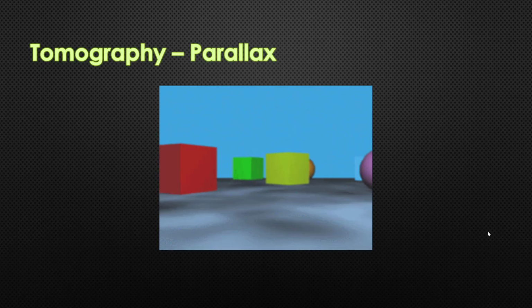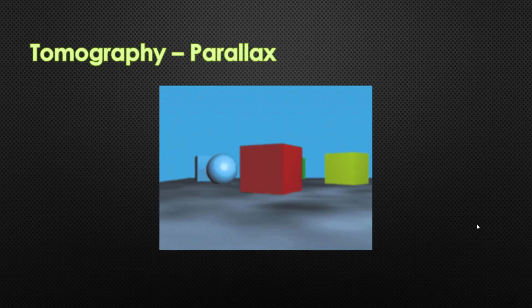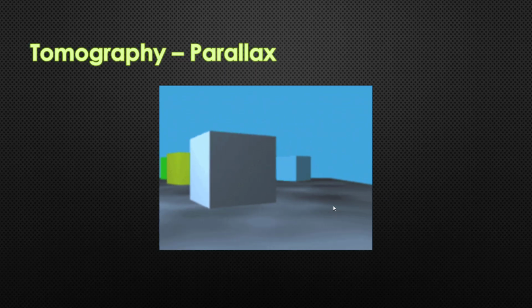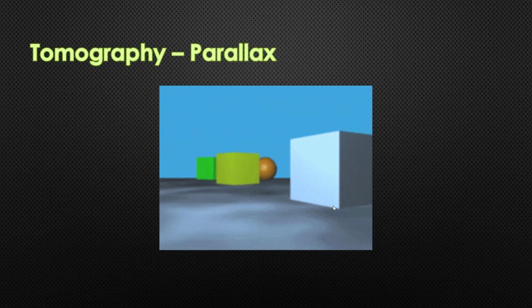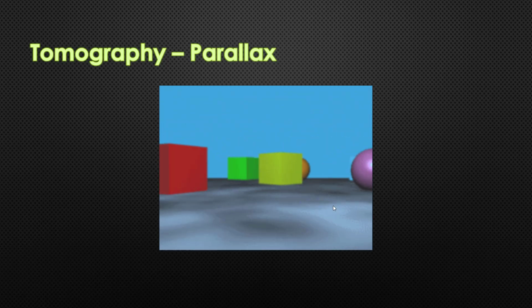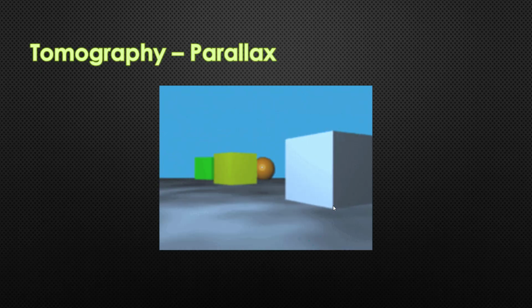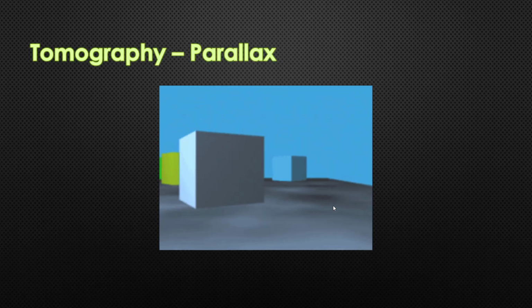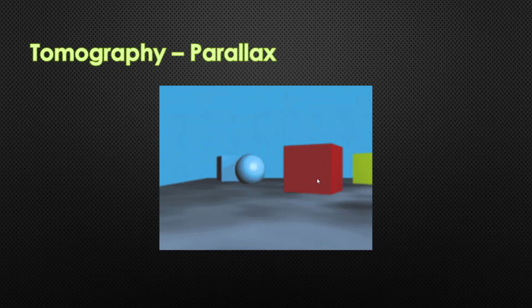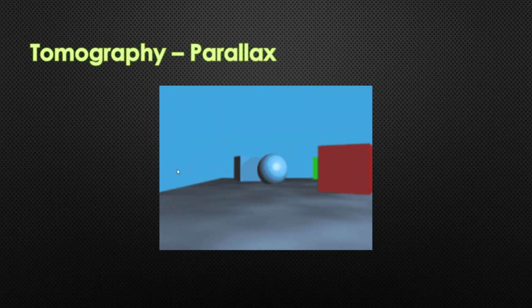So this is the parallax principle. It looks like our eyes are moving back and forth, right to left, correct? Imagine your eyes are an X-ray source, and now imagine you want to image that yellow cube. How would you move a sensor in relation to the moving X-ray tube to make that yellow cube stay in focus, while everything else is blurred and stretched across as it's passing in front of and behind that yellow cube? If you line it up perfectly in sync with that yellow cube, everything else is just going to be blurred across the rest of the image.